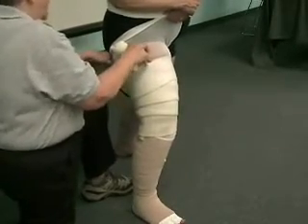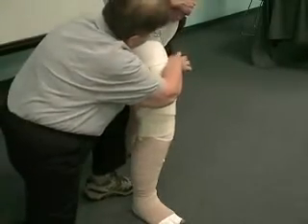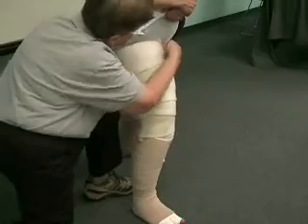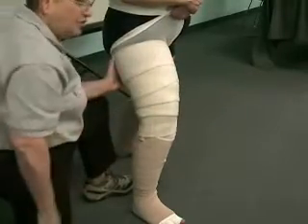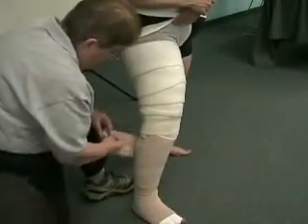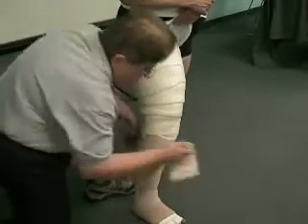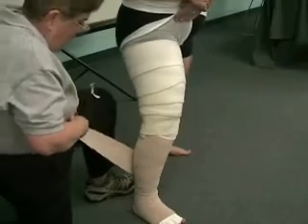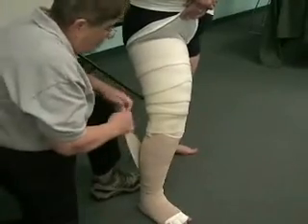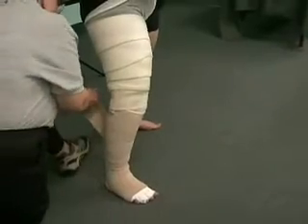Come up as high. Right here's the gluteal fold. So you're going to really angle your bandage right into the angle of the groin and come all the way back in towards the gluteal fold. Now I could do two things, and then again, I never bandage the same way. So it never bothers me. I always have a lot of time because what I look at in a patient is what am I going to create. So if I have enough bandage, I could have come up, but since you all don't have enough bandage, just now take it around and go up.